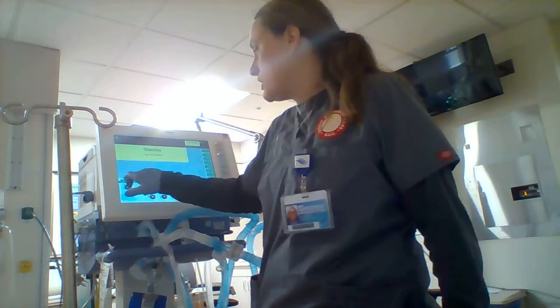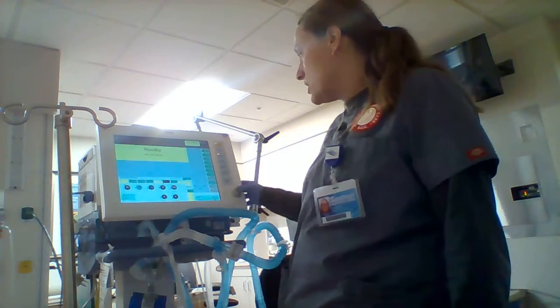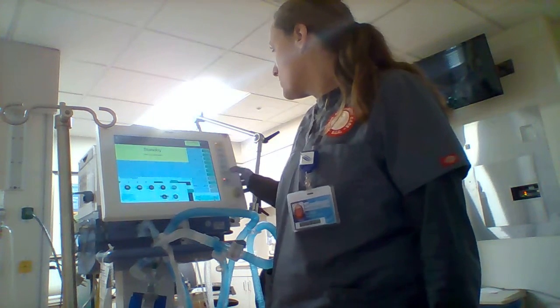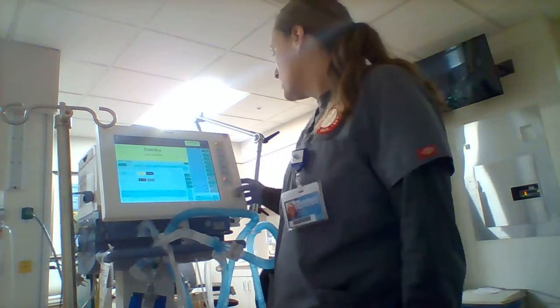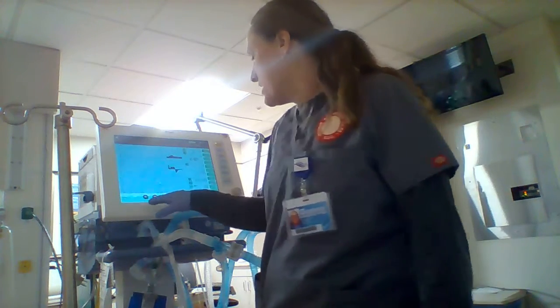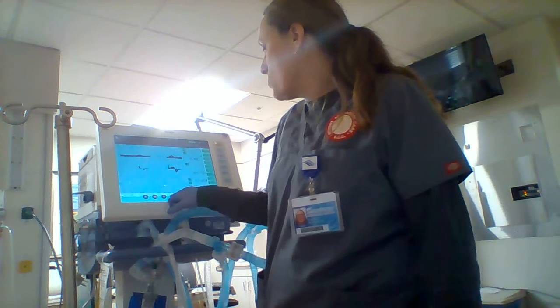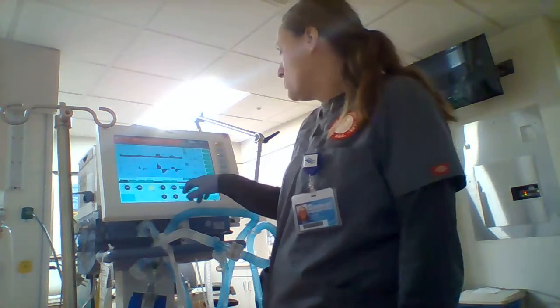Let's go to SIMV. It turns yellow when you touch it, and then you touch the yellow button. Start. Okay, perfect. So we are actually ventilating the patient. 50% O2, tidal volume of 380, inspiratory time 1.1, gives me an E time of 3.19.